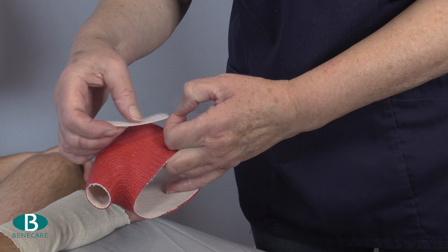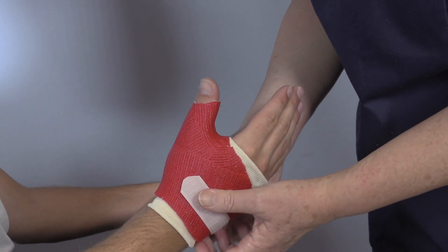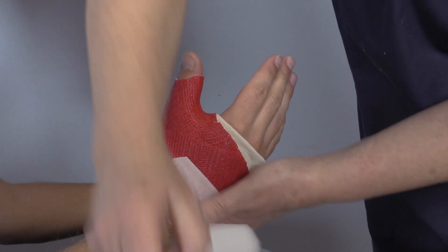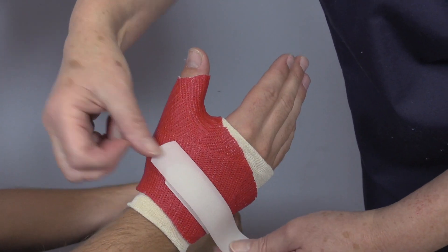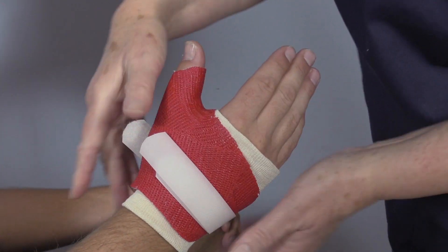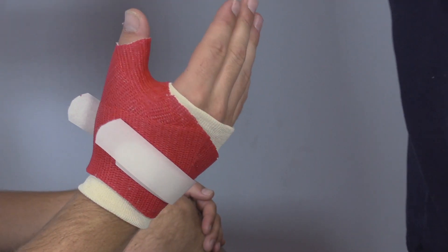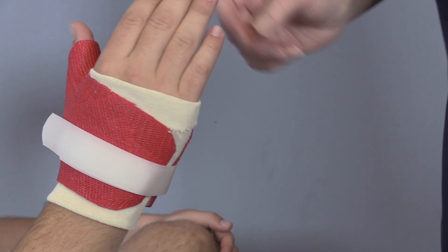Apply two pieces of adhesive hook and reapply the cast to the limb, then secure this with non-adhesive loop. The cast should fit securely. It should allow full function of the joints that are not held within the cast and be comfortable for the patient.